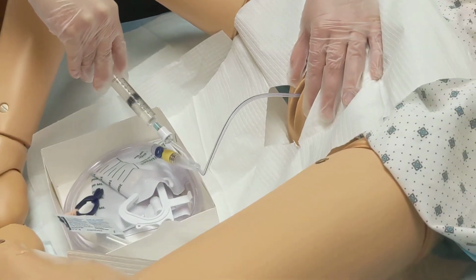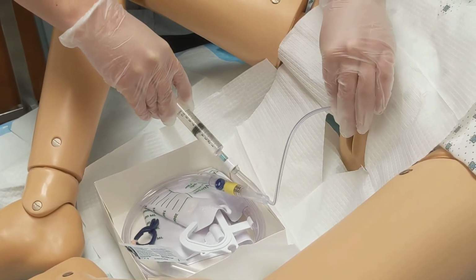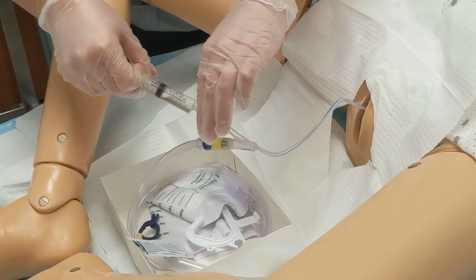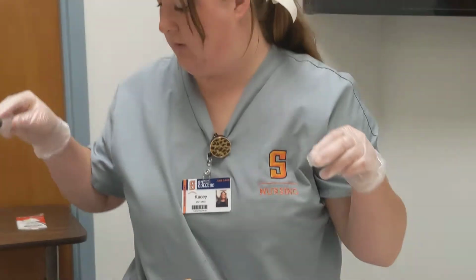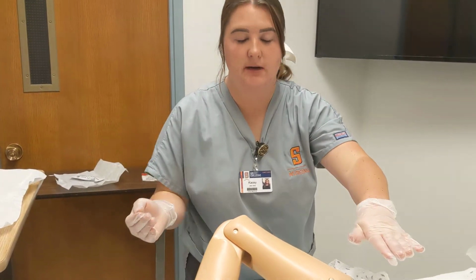So we'll go to right there, and now I'm going to ensure it is in, and now I'm going to disconnect this. Disconnect that. And now we're finished with the sterile part.